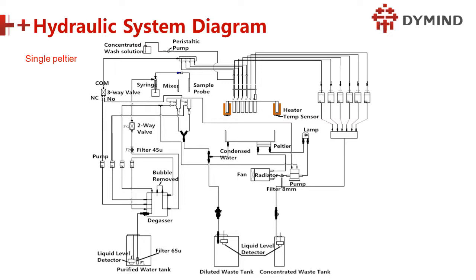The mixer, as I mentioned, will also move to this cuvette for mixing, right? This is physical mixing, and it is different from the hematology analyzer. In the hematology analyzer, we use bubble mixing, and the bubbles go from bottom to top and mix the blood with the reagent. Then we do measuring, right? So here we use a mixing bar. But remember, this is multi-use. We have many samples, right?